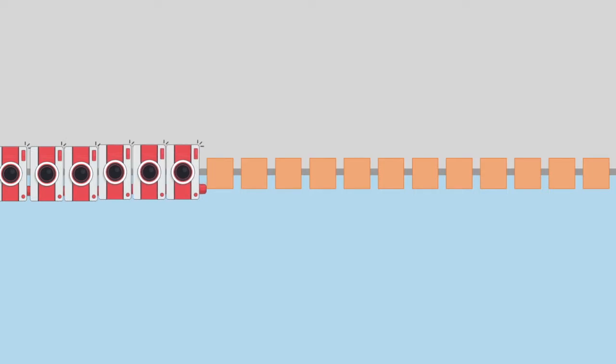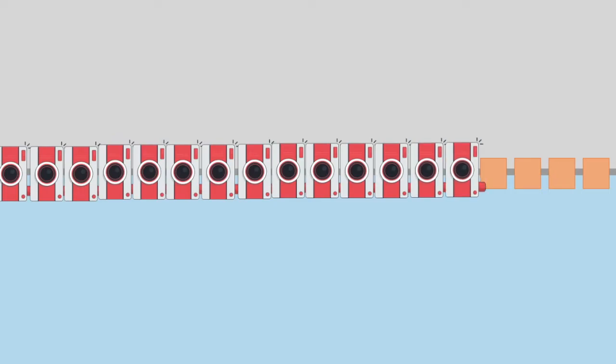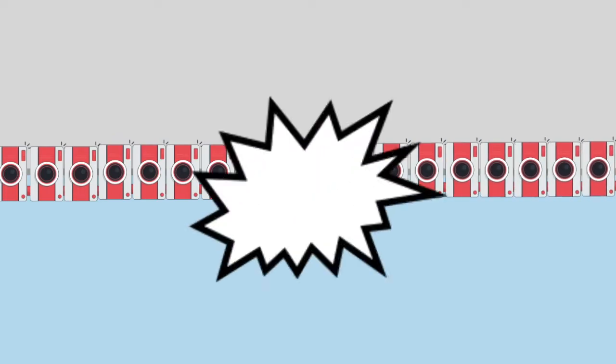If we take a closer look, each ultrasound probe has a series of tiny sensors on them. Each of these sensors is like its own individual camera, which is working together to make one image that gives the doctor or the researcher a better idea of what is going on. Well, how does an ultrasound sensor create an image?